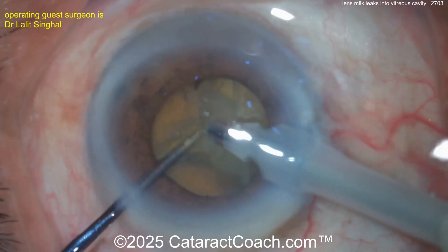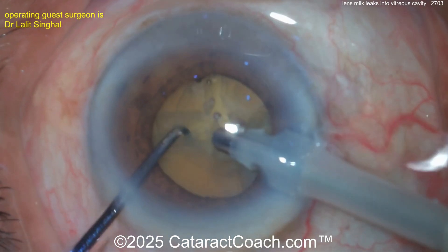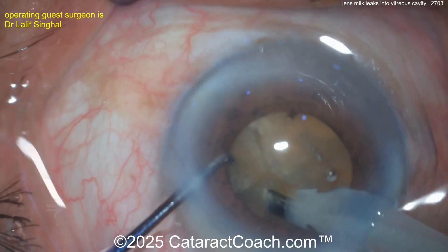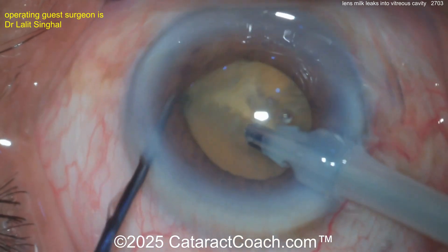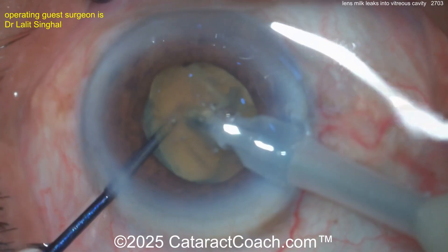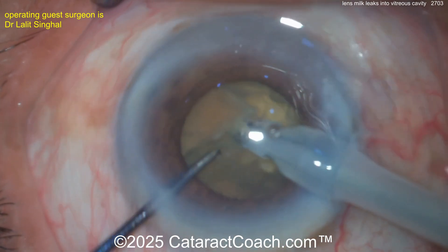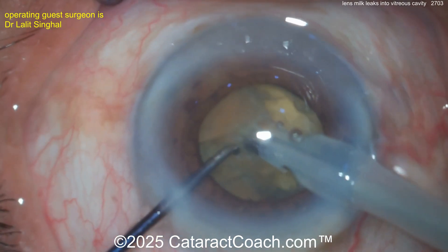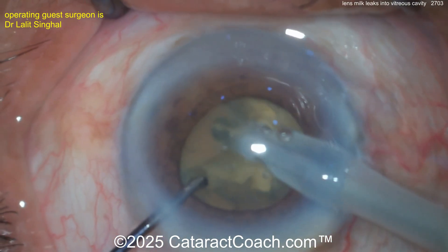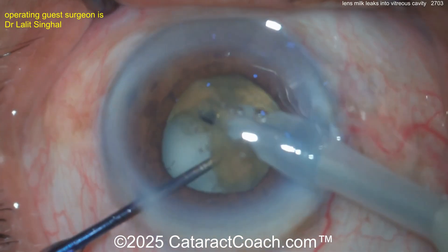So how do you get the lens milk or liquefied lens material out of the capsular bag? There must be some permeability to the posterior capsule. You can see a large amount of liquefied lens material — lens milk — in the vitreous cavity, probably collected in Burger's space, in front of the anterior hyaloid face. That's going to make visualization poor.